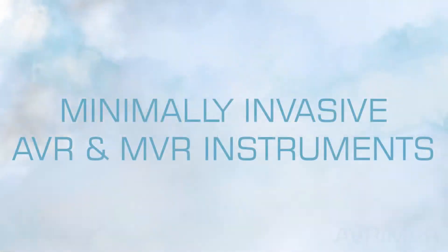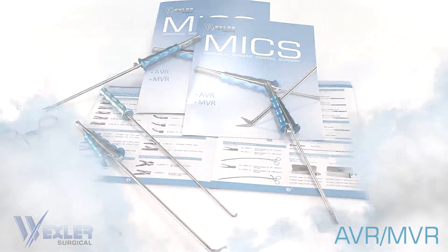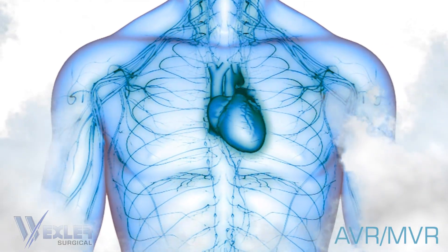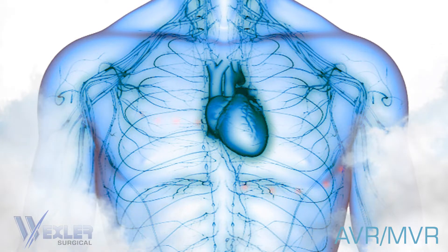Wexler Surgical presents minimally invasive instruments for MVR and AVR procedures. Minimally invasive procedures are done through small incisions and with specific instruments.